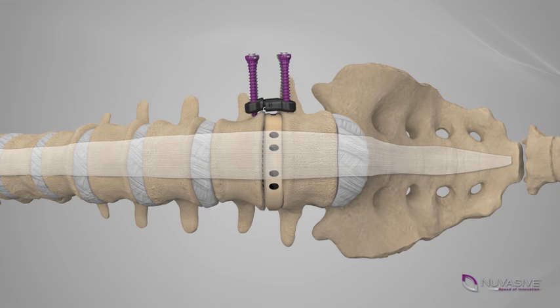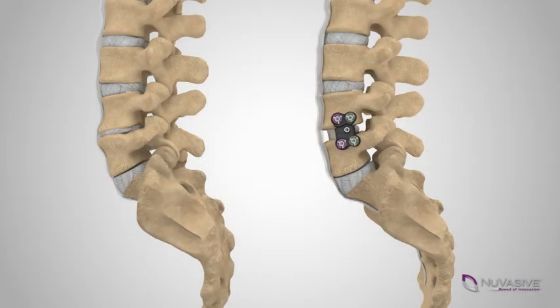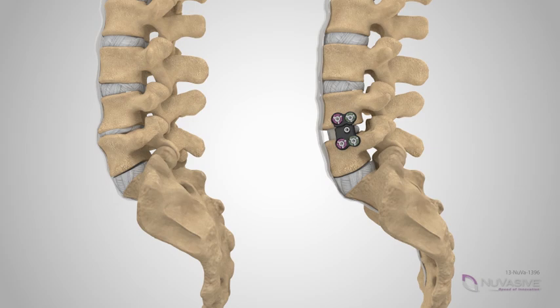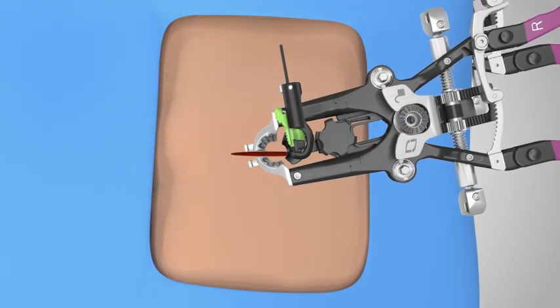Generally, some method of internal fixation will be used to act as a stabilization device, or internal brace, to help hold everything in place while fusion occurs. This could be a combination of screws and plates that are affixed to the adjacent vertebrae.